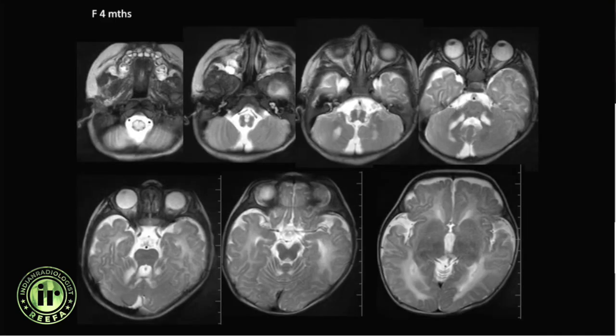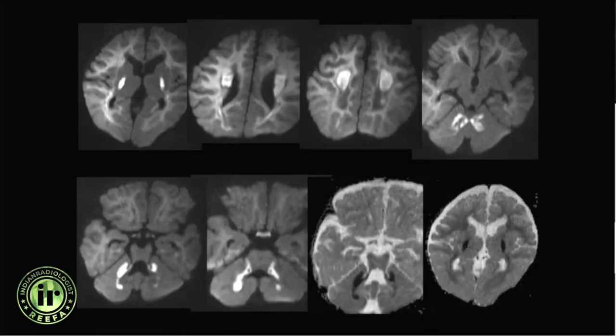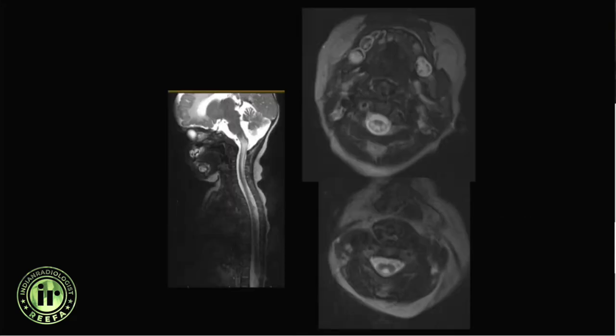Another patient with diffuse periventricular signal abnormality also had abnormality in the brainstem, upper spinal cord, and cerebellar hemispheres, with restricted diffusion seen in the periventricular regions. There was also diffuse long-segment spinal cord involvement. This was diagnosed as mitochondrial complex one deficiency.